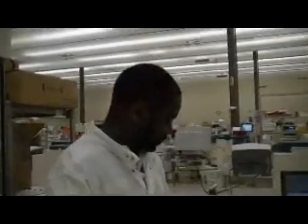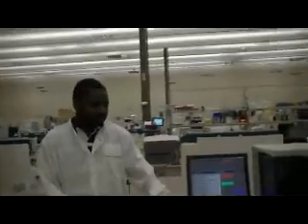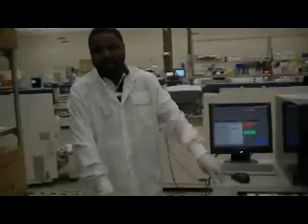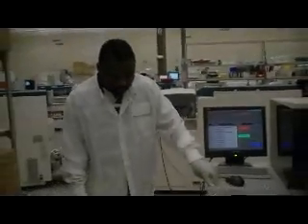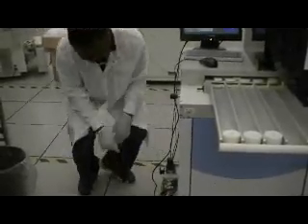Okay, today I'm going to show you the PM on an inoculab. This is a machine that's used to streak urine cultures. First thing is first, check your wires, your cables. In this building, our electrical lines and computer lines are all under the floor because we've got a subfloor. So that's where you see all these. You can just double check to see if they are all intact. There are no cracks or anything.